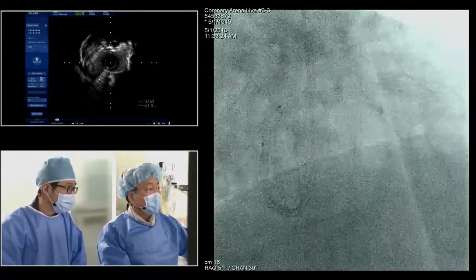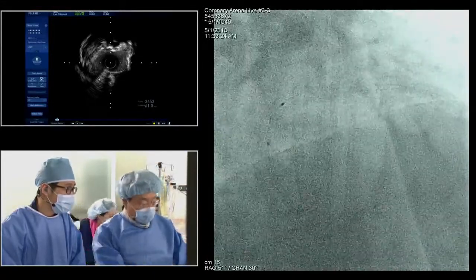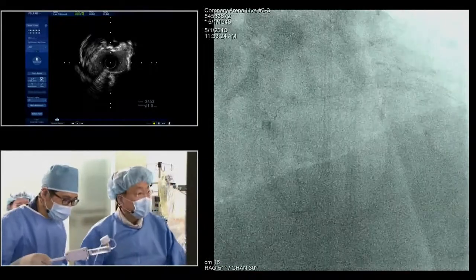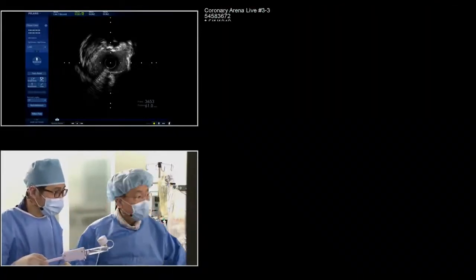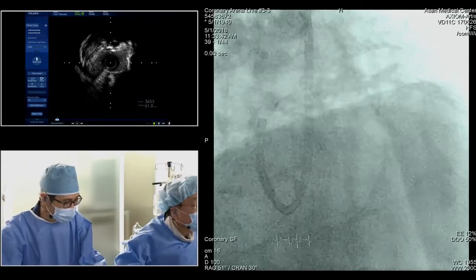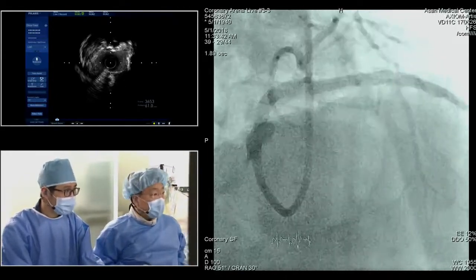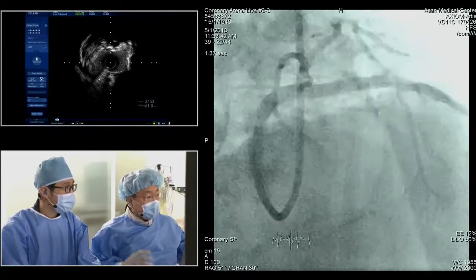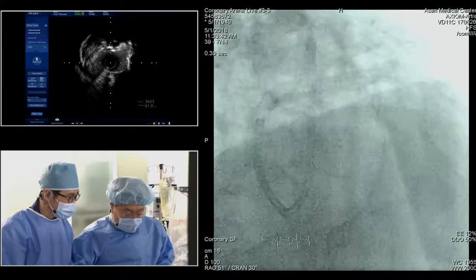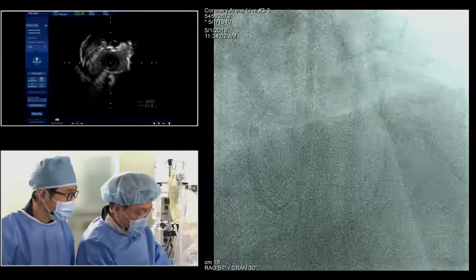During the balloon deflation, I want to pull the guide in. I want to stand inside the stent, and then I want to see what happened. Picture. All right. I'm sure that it is covered by a stent ostial part. However, still, expansion is not so big, and so I would like to use what about the 4.5?